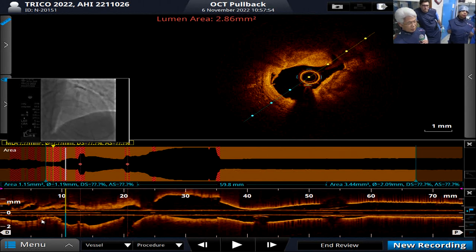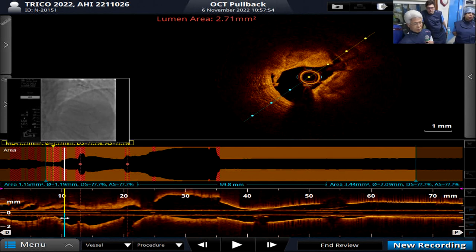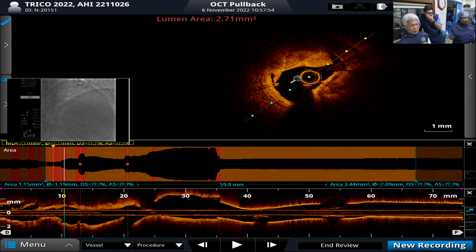Akzak and the team their thoughts on when you have still calcific stenosis but dissection present after a balloon, your thoughts on atherectomy strategy? You're so comfortable with it later, or you go IVL nowadays? Thoughts on that, pre-stent? It depends, but he succeeded to make a dissection here, so it is dilated by ballooning or stenting because we have already the dissection, right?